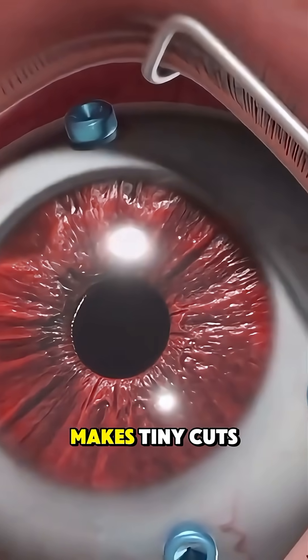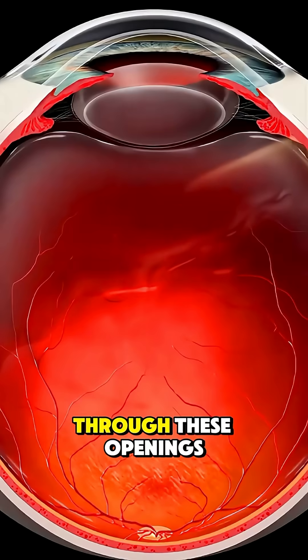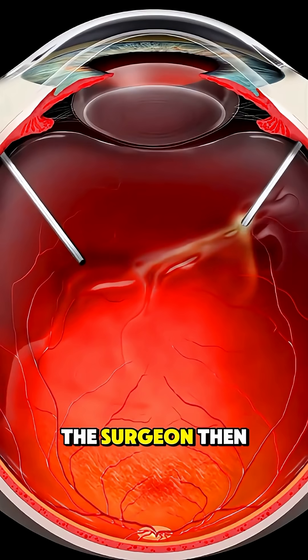The surgeon first makes tiny cuts, each about the size of a needle tip, in the white part of your eye called the sclera. Through these openings, delicate instruments and a fiber optic light are inserted to see clearly inside the eye.